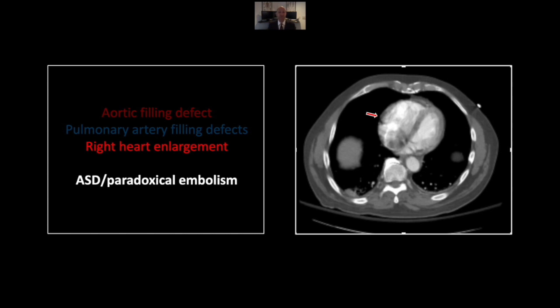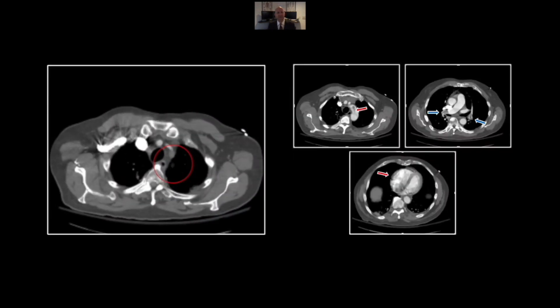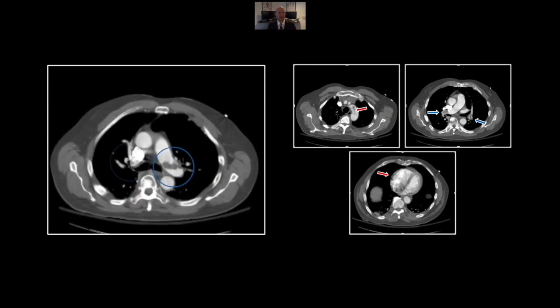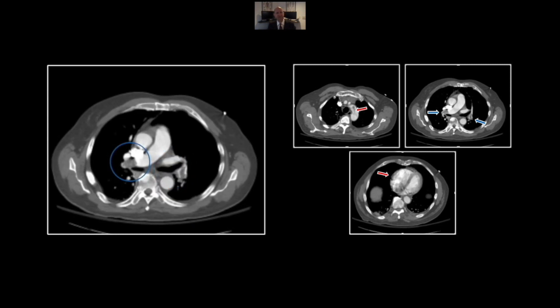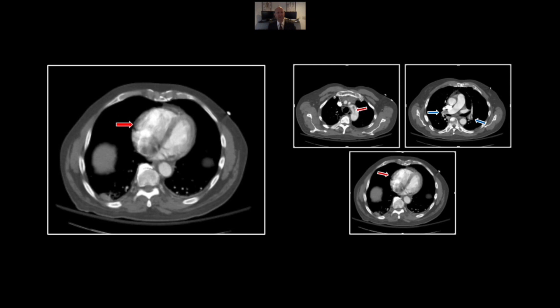If you look in the septal region here, that is artifact. I have gone over and over it, and you really can't identify the ASD on the CT. But you can see the secondary effects of it in that right heart enlargement. There is the left subclavian clot and the aortic clot, and here are the pulmonary arterial clots. Note again that slight right heart enlargement.